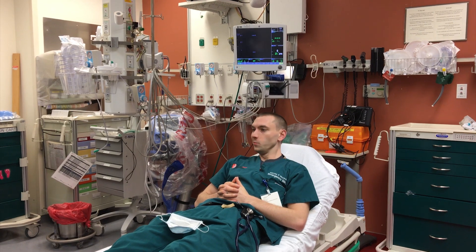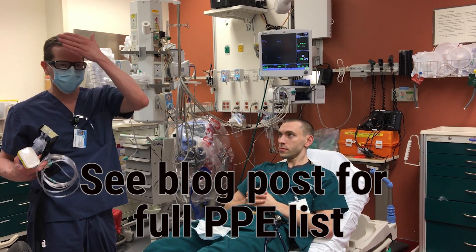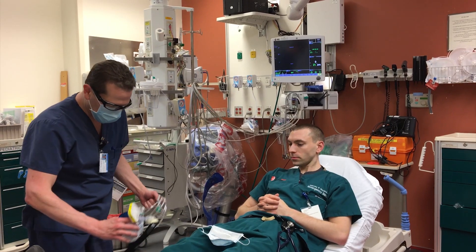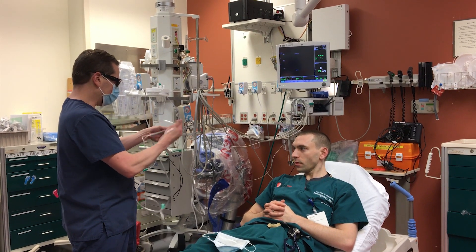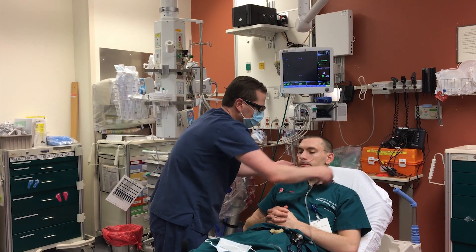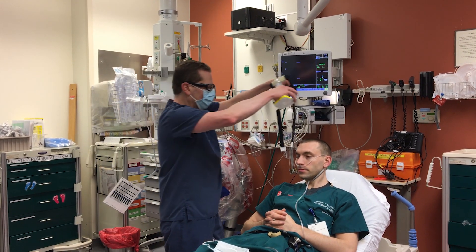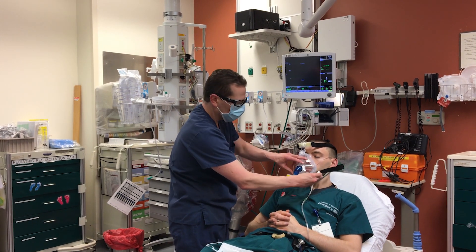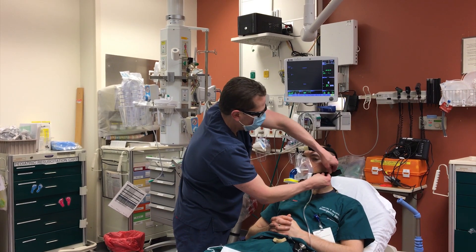We've now entered the room. We are in full PPE — it should be bunny suit, N95, surgical mask over the N95, some form of eye protection, preferably full face visor or hood, and double gloves. The reason we took those three items out ahead of time is the first thing we're going to do before we set up for intubation is get the nasal cannula on. It doesn't need to be on oxygen — in fact, it's preferable for it not to be right now. Then we're going to cover the patient with the non-invasive mask and the viral filter already firmly attached to it, because as soon as that goes on, the only exhalation that's going to hit you is what's leaking out of the side of the mask. And once this is on, we are a lot safer.